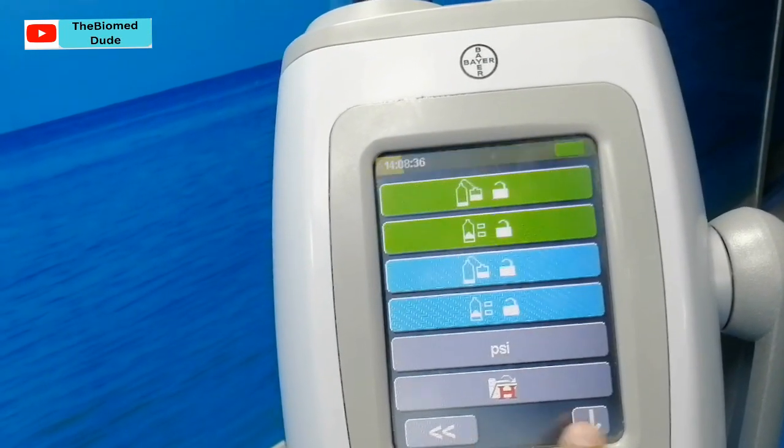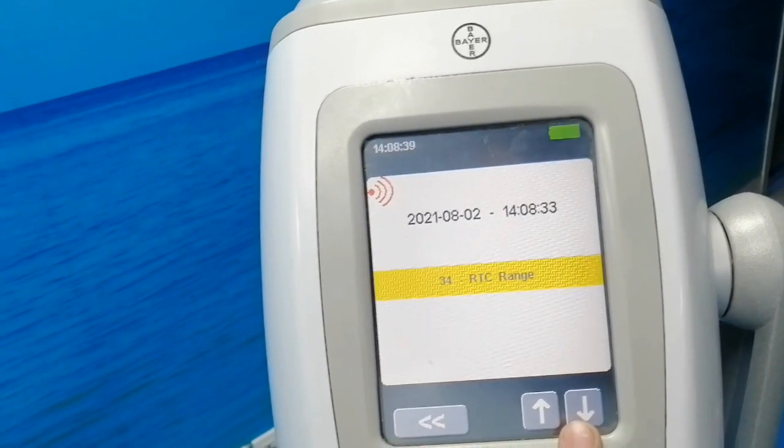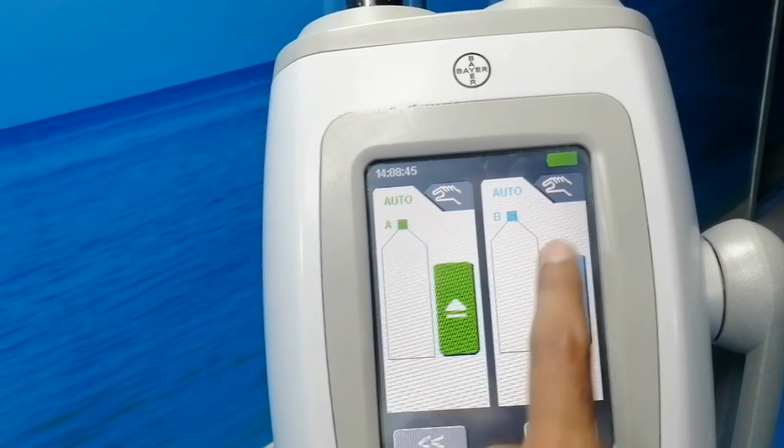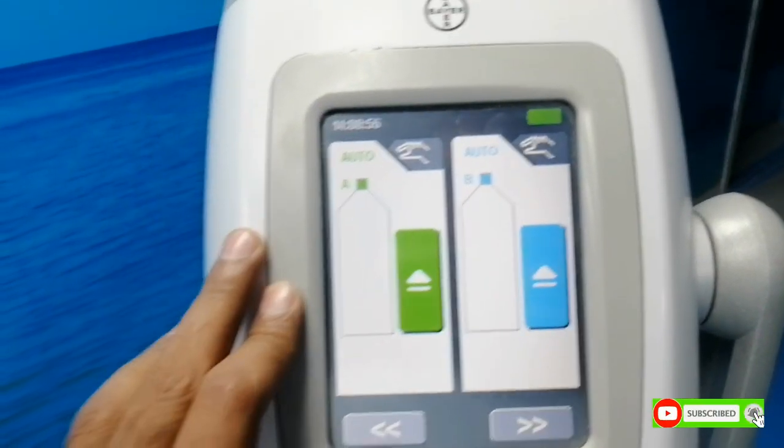Here is the menu switch, here is the back switch, and here is the forward switch. There are two injectors — here is the normal saline line, and this one is used for the contrast.